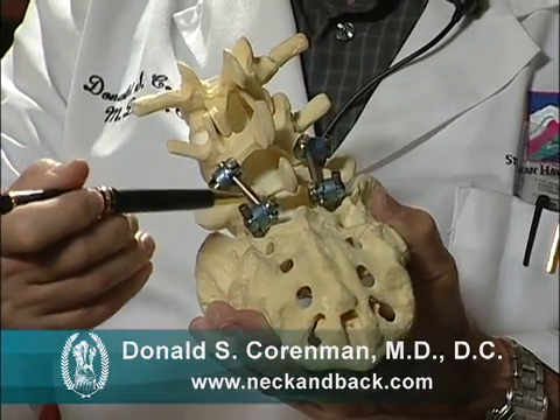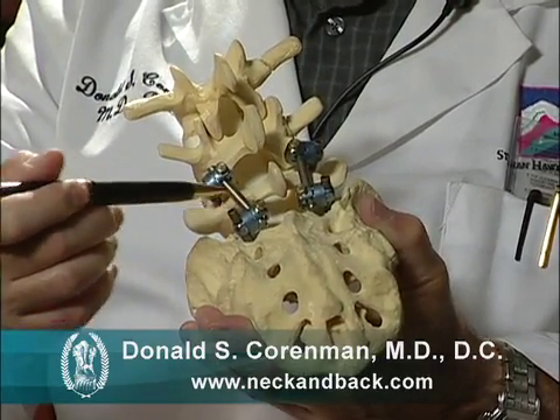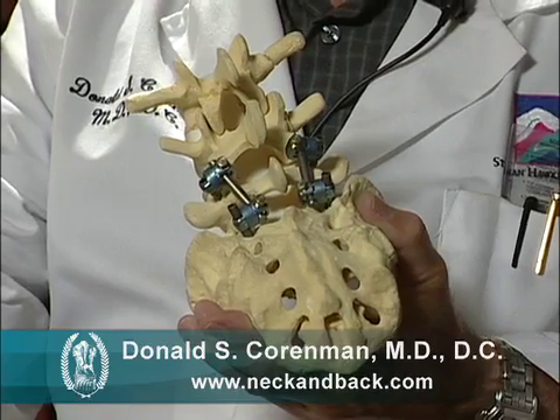This is done by locking the vertebra down with these particular screws and rods, but this is really just an internal cast.